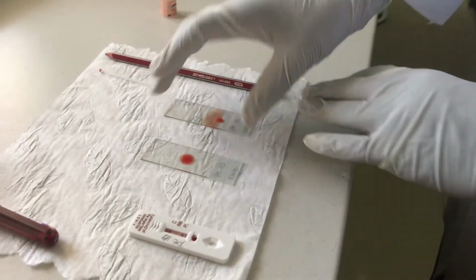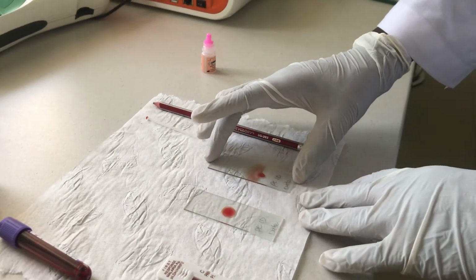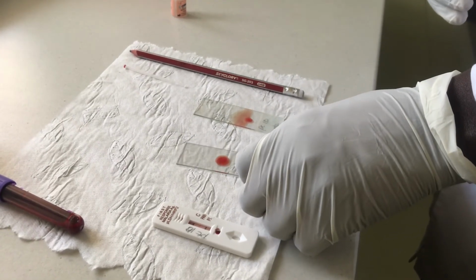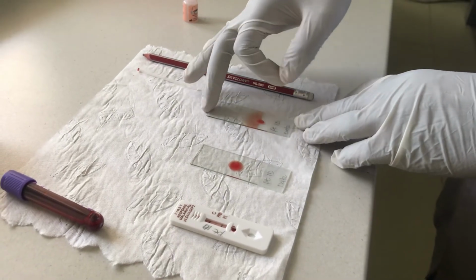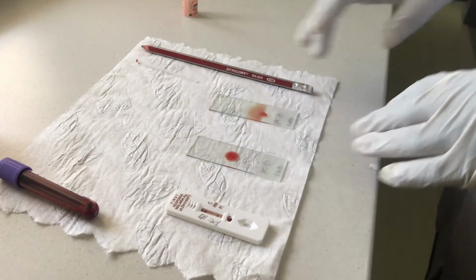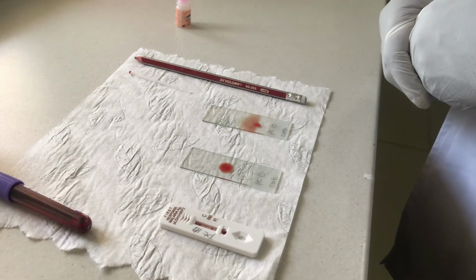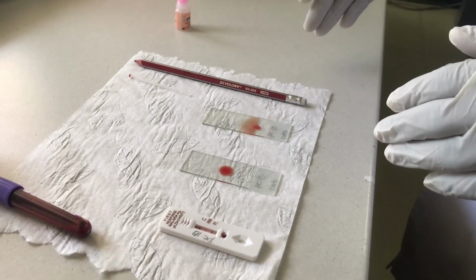So these smears, you leave them to dry, and after drying, you'll be able to stain them. You'll use this to detect whether truly they are Plasmodium parasites, and you'll use this thin smear to quantify them, either in percentage form or per the number of WBCs you have seen, or you can quantify them per high power field, depending on what you're comfortable with.